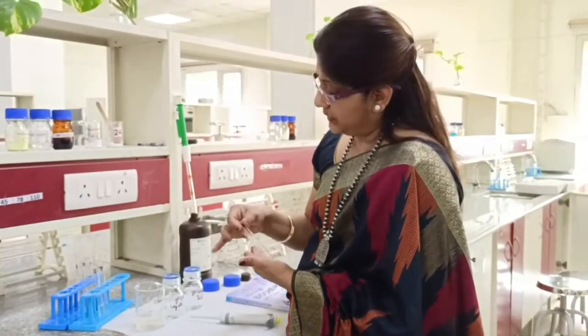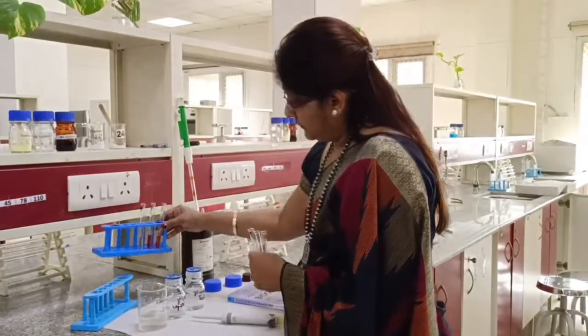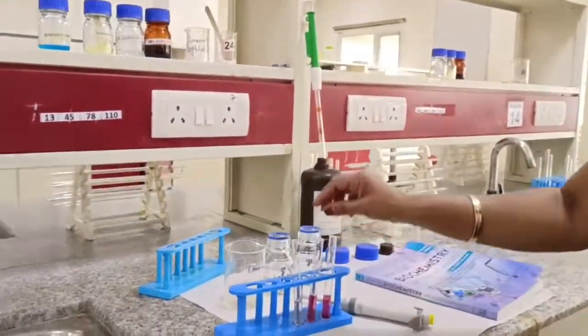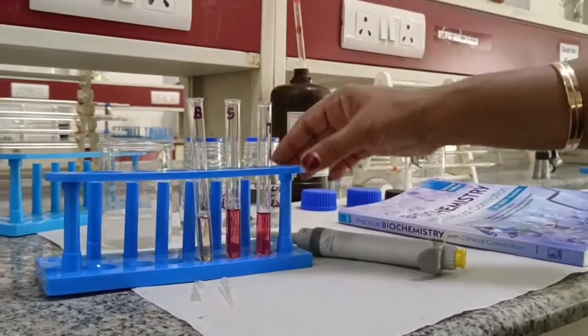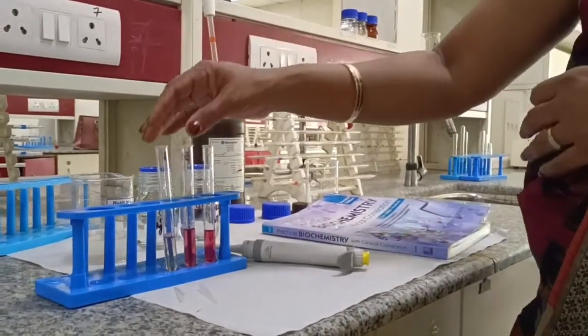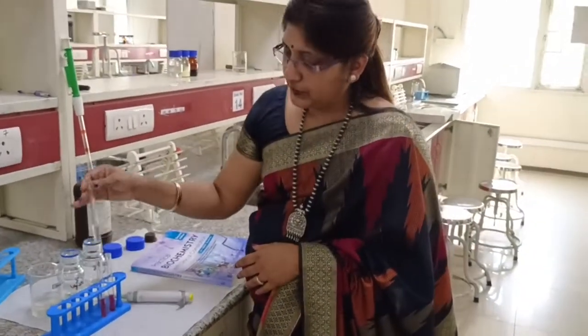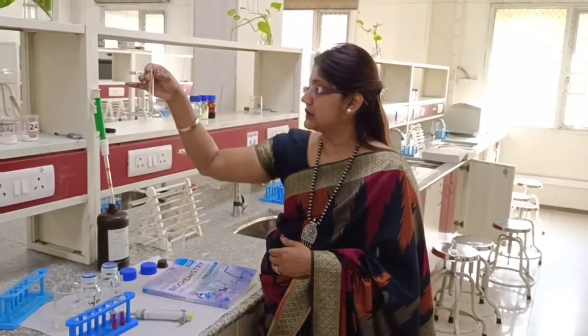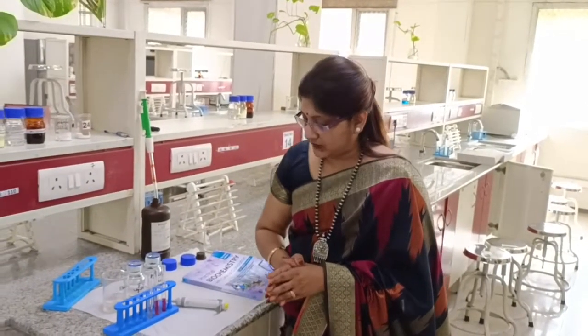Leave it for 15 minutes at room temperature. You will see — I have already kept a processed set — a pink colour in the test solution as well as in the tube having the standard solution. A slight pinkish tinge can also appear in the blank tube, which contains only the reagent and no test or standard solution. This is due to impurity of the reagent giving this pink colour. The blank is used in all quantitative assessments in biochemistry practicals to rule out and deduct the colour developed by the reagent itself.